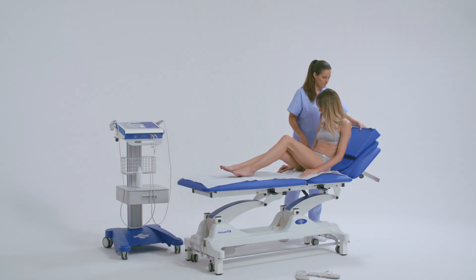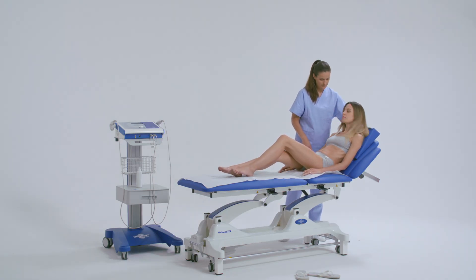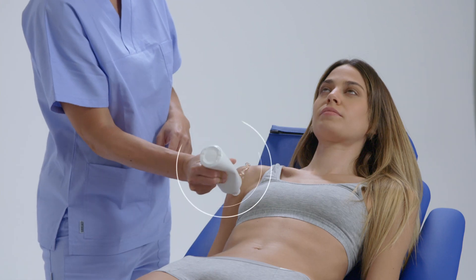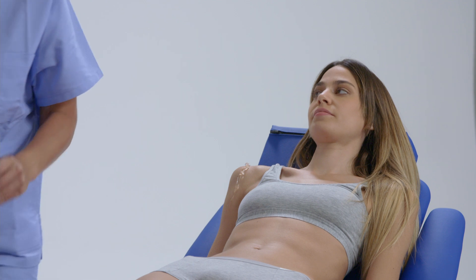Before treatment, ensure that the patient is positioned comfortably and appropriately for the therapy. Then, apply an abundance of specific gel to ensure optimal transmission.